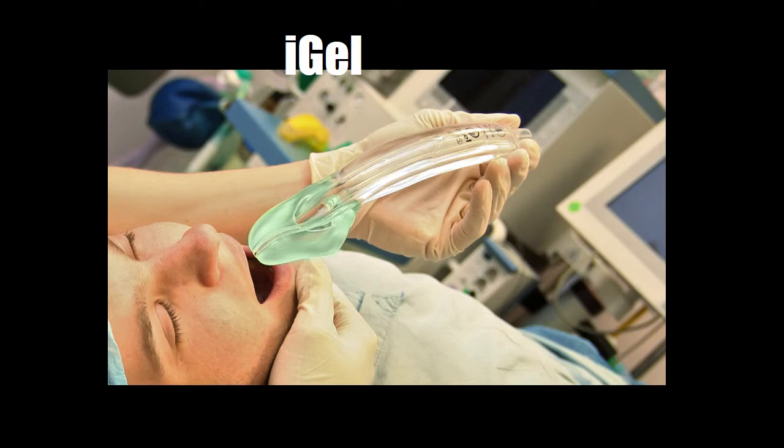So going back to the point, we need 5% aqueous lignocaine to put in the easy spray or the MAD. The easy spray seems to have benefits over the MAD in that it's more directional and it gives better atomization. The MAD is just a syringe attached to a thing which you plunge. Whereas the easy spray, you just press a button and occlude the lumen, and it sprays as you want it to. And you put a volume of like 10 mils into that. And then you have 5% lignocaine ointment, which again we don't have in ED, but they have in theatre.